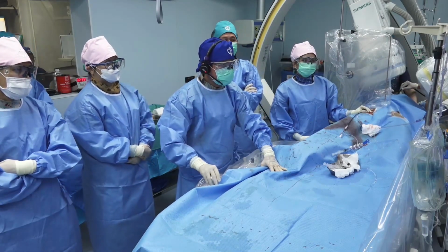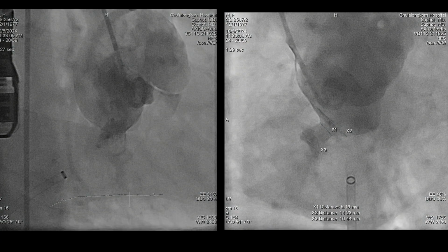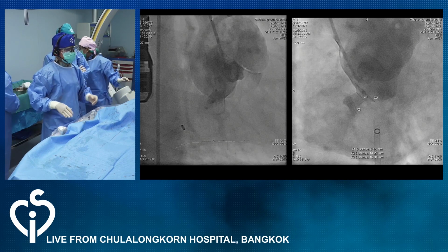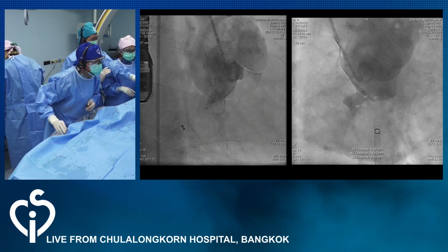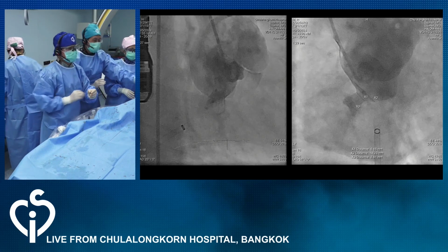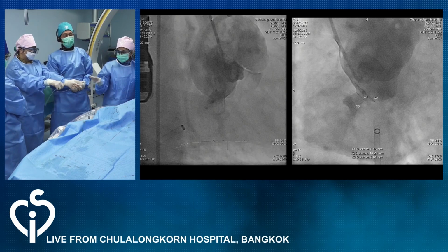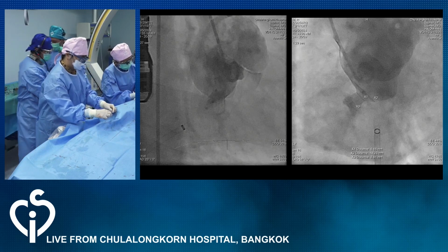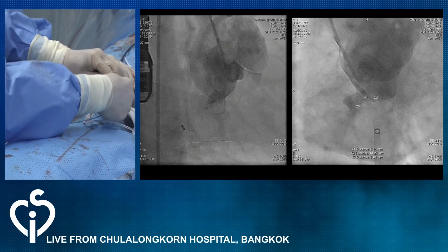Before coming out, I would do 2 things. Not that it would change anything, but I would definitely auscultate this patient to see whether the murmur is there, although we have lost the art of auscultation. And second, look at the pulmonary artery pressures, what has happened acutely, because I don't find this LV to be that bad truly on transesophageal echo. So that pressure probably is shunt related, and we may have some changes in the PA pressures immediately. It may be some other disease process going on as well. So are you going to remeasure the pulmonary artery pressures as well?